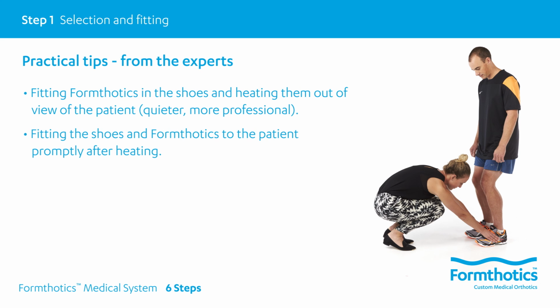Fit the shoes and Formthotics to the patient promptly after heating. The patient feels the warm Formthotics and immediately feels the effective support. This is also the best moment for heat molding, where the foam is at the optimal thermoforming temperature. If the Formthotics were not properly taken off the machine when completed, simply heat them again.